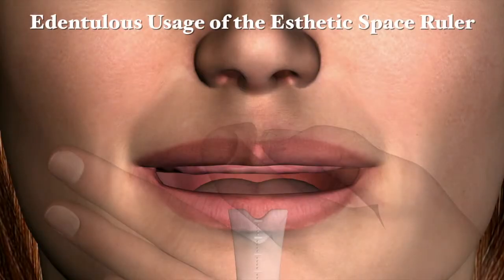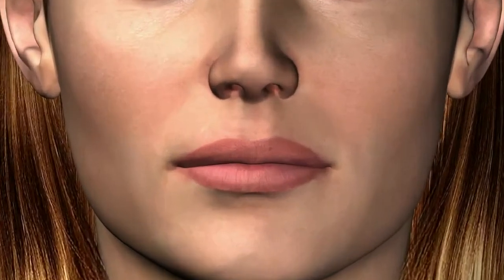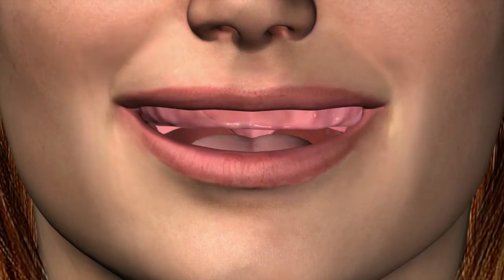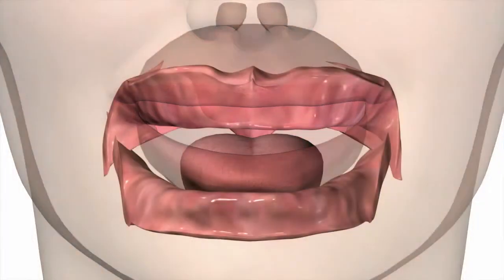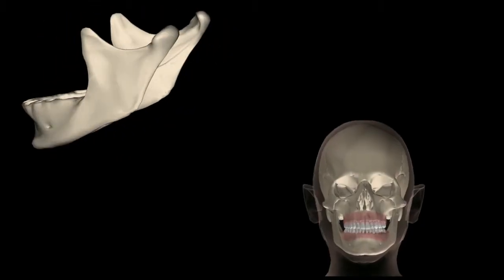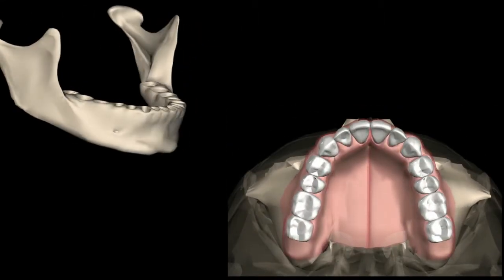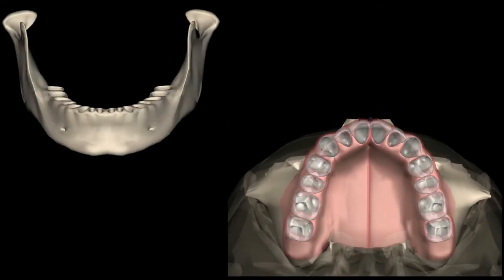Edentulous usage of the aesthetic space ruler: for the edentulous maxillary patient, the Mossad Aesthetic Space Ruler gives the practitioner the ability to fully evaluate the palatal height in reference to the shortest ridge height, which directly relates to the amount of retention that can be achieved in a denture prosthesis. This measurement can be quantified for classification purposes, such as class 1, 2, 3, or 4, going from the best to the least ridge condition.